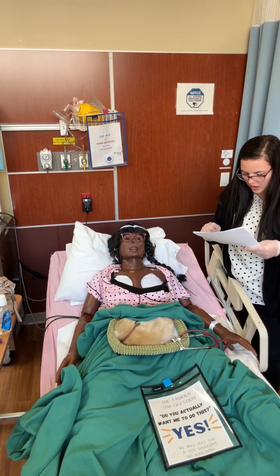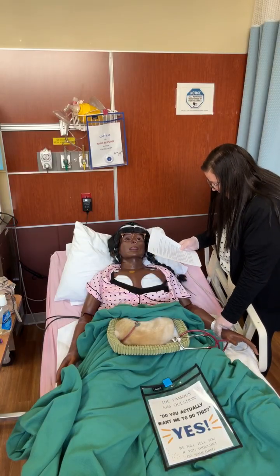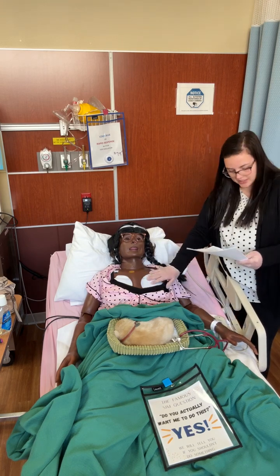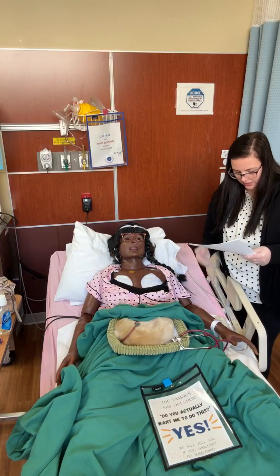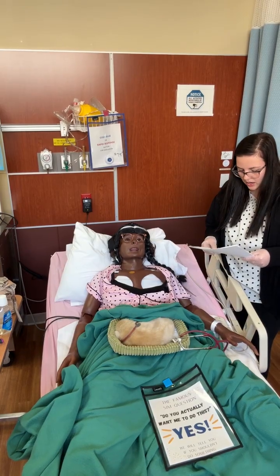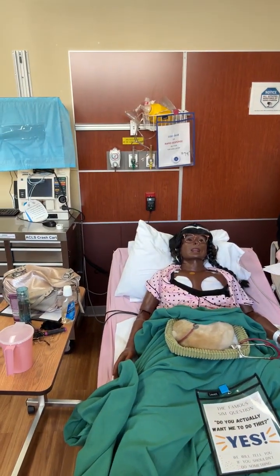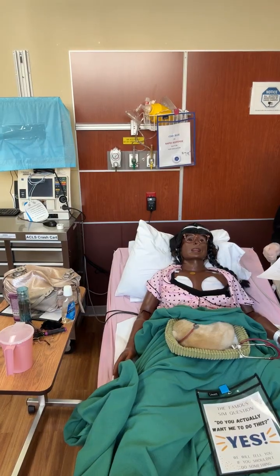When you are listening, it is not cheating to also palpate for that pulse. That way you can match up what you're hearing and what you're feeling. You're always going to assume that this white fabric is her skin. And it is okay to listen and feel at the same time. You're going to want to confirm the heart rate or the respiratory rate that you got with sim staff. So, for example, if I got 100 beats per minute, you would just say, sim question, I got 100 beats per minute, and we will confirm that.